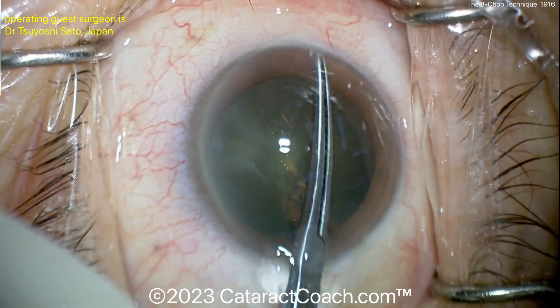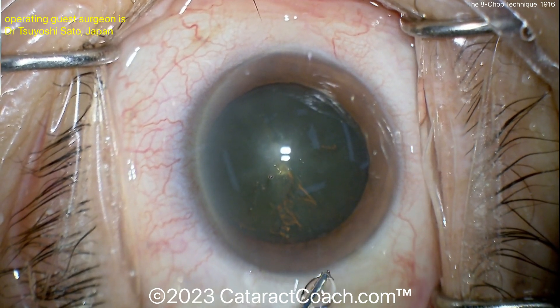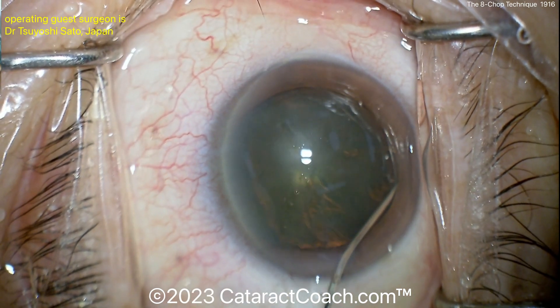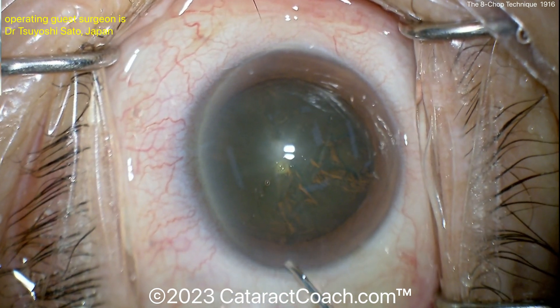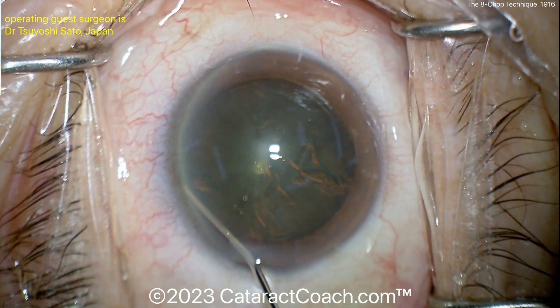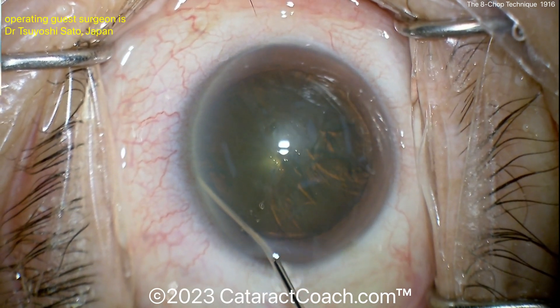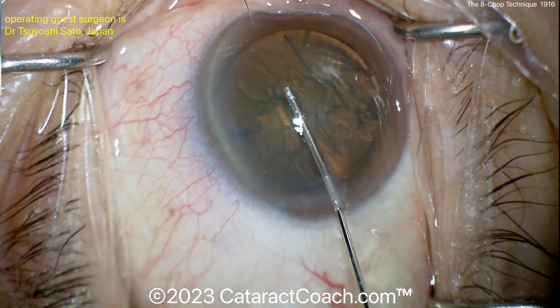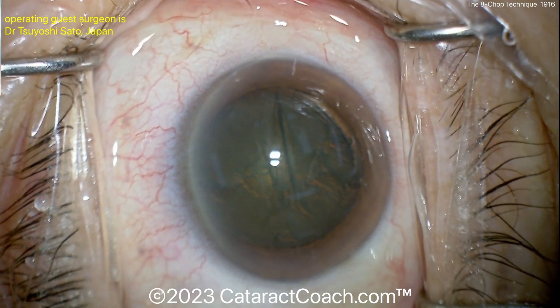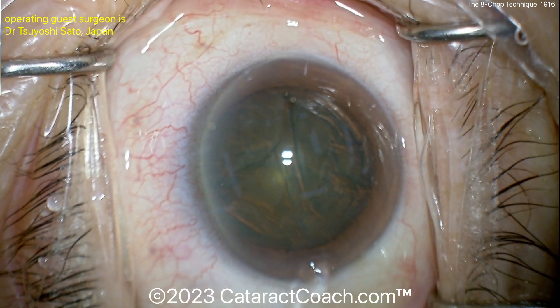Now the hydrodissection and the pre-chopper. The pre-chopper is a popular technique in different areas and allows you to split the nucleus right off the bat. The nucleus looks to be relatively modest in nuclear density. With a technique like this, if you're going to do all those pre-chop fragments or eights, you definitely want good hydrodissection so the nucleus will spin.